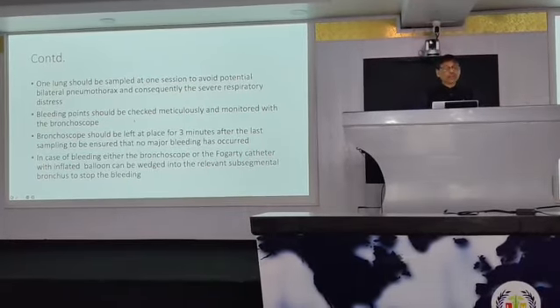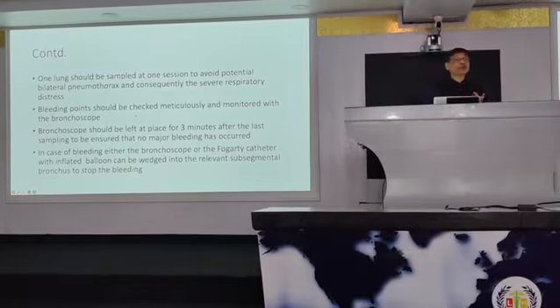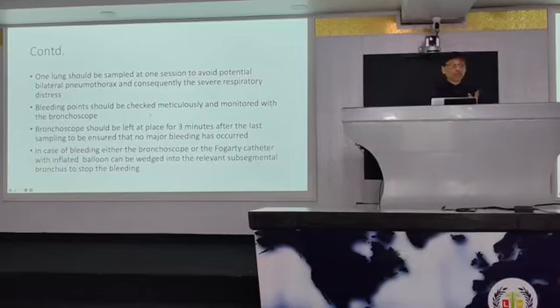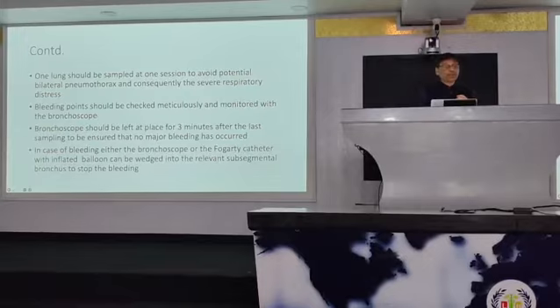Bleeding points should be checked meticulously and monitored with the bronchoscope. Here there is more chance of bleeding. In endobronchial biopsy there was little chance, minor bleeding and self-limiting, but here there is a chance of more bleeding. So the bleeding point should be checked meticulously and monitored with the bronchoscope.